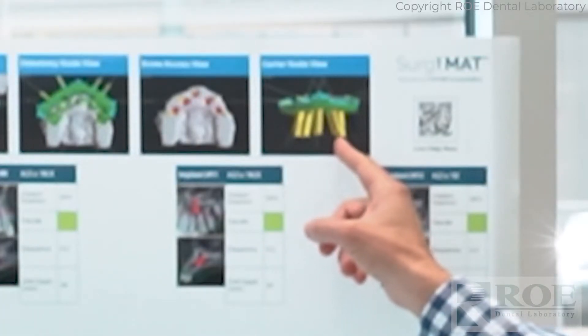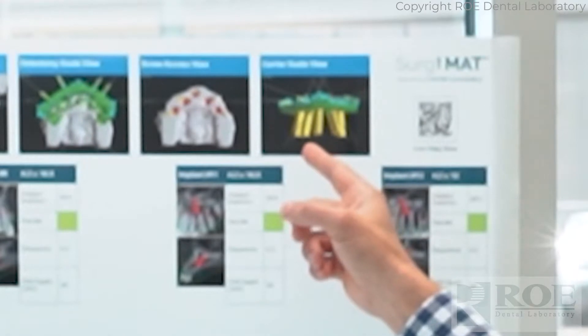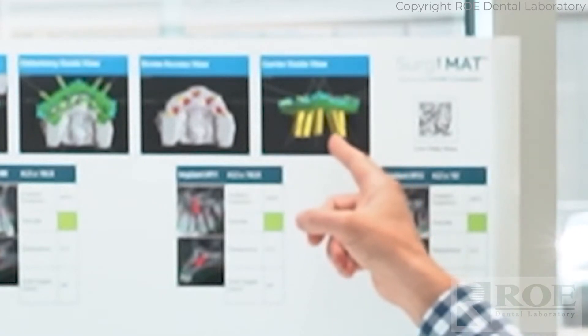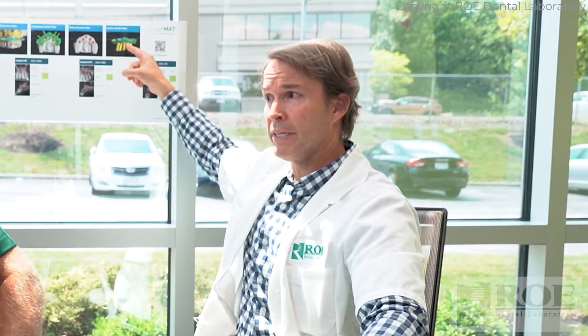One of the other reasons implant rotation is key is getting the abutments lined up correctly. Looking at this image, you can see the temp cylinders — if you're in surgery you might think one isn't in the right position, but you'll look at the plan and confirm it is exactly where we planned it. A little bit of sticking out is expected. If you see this in the mouth, you know the implants are in the right place, your abutments are in place, temp cylinders are all aiming correctly, and you should have a draw — and that draw is key for screw position long term.